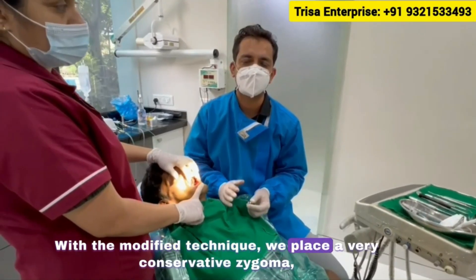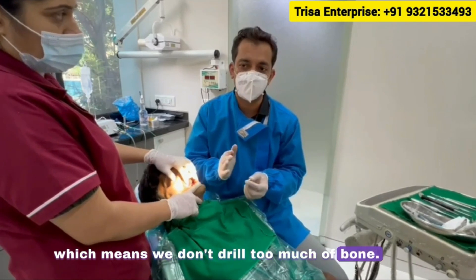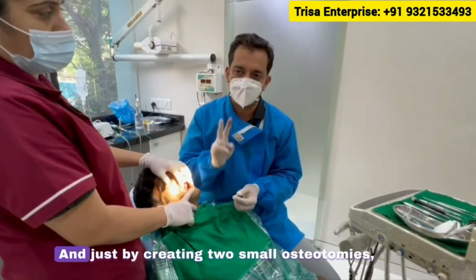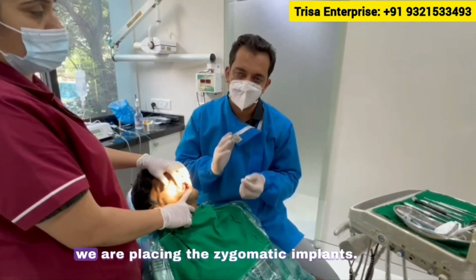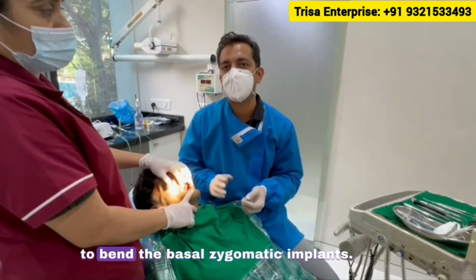With the modified technique, we place a very conservative zygoma, which means we don't drill too much bone. We raise a flap but don't create a very big lateral window. Just by creating two small osteotomies — which I call the two-hole technique — we are placing the zygomatic implants.